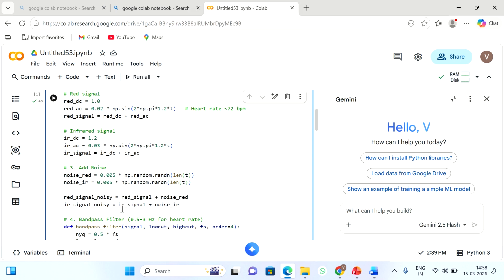In the same way, for the band pass filter, we are taking the lower cutoff frequency as 0.5 and the higher cutoff frequency as 3 Hz. It is for a normal human being. The heart rate frequency lies between 0.5 and 3 Hz. So below that will not be allowed, and above 3 Hz will be taken as noise. That is why they are removed.